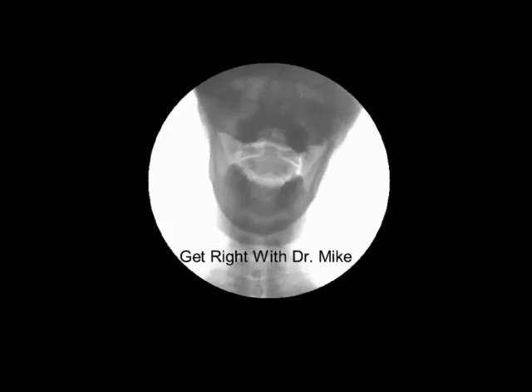We're going to see that when she bends to the right, her C2 doesn't move very good, but when she bends left, it bends really good. So we can watch that one more time. She bends right. The C2 doesn't move very good at all, but she bends left and it bends really good that way. So we know that C2 and C3 cannot bend to the right.